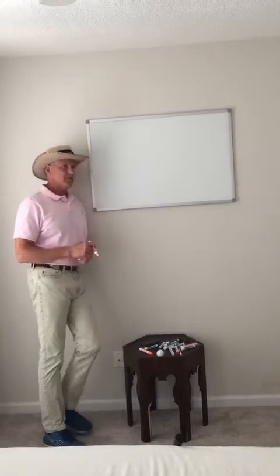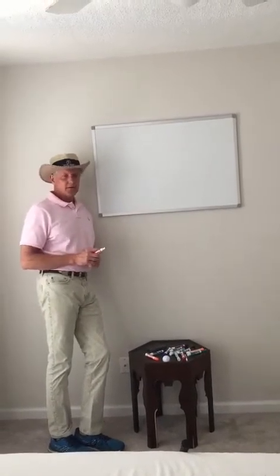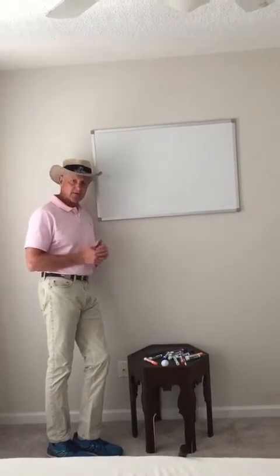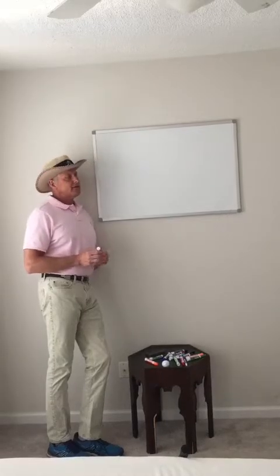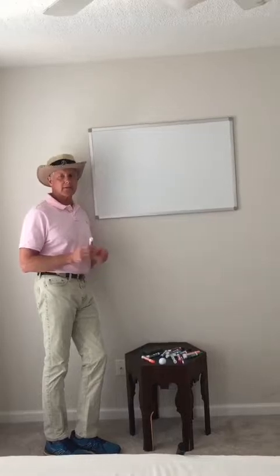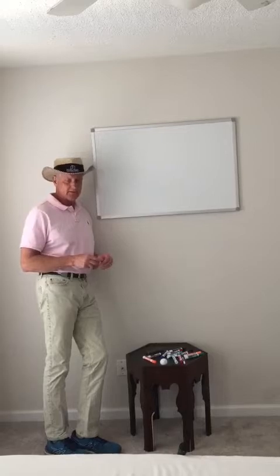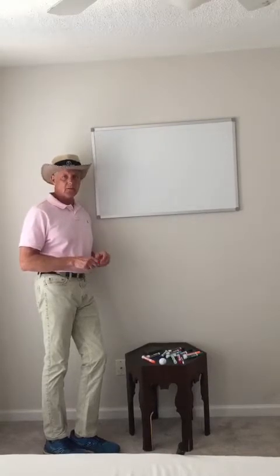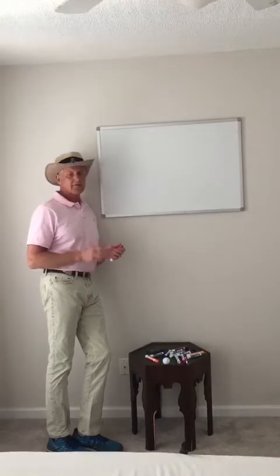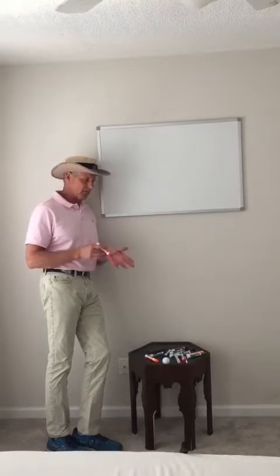Okay, so what is an EKG machine and what does it do? Well, in a nutshell, the EKG machine was designed by a person years ago that was intended to record the electrical activity of the heart, because the heart is one of only two organs of the body that is electrically charged. And as it goes about its work, meaning contracting and delivering blood to the body, it leaves an electrical trail that can be inscribed on a piece of paper or on a computer.